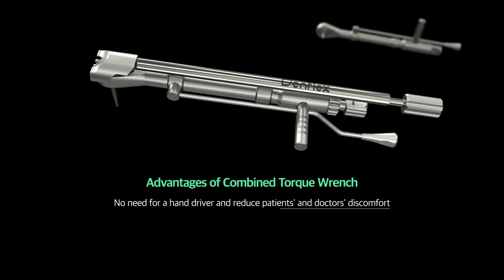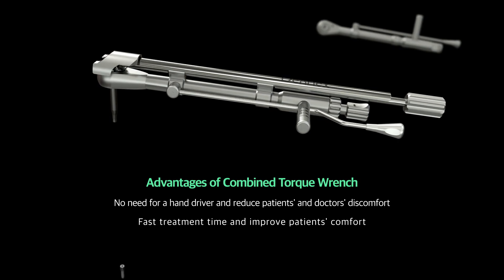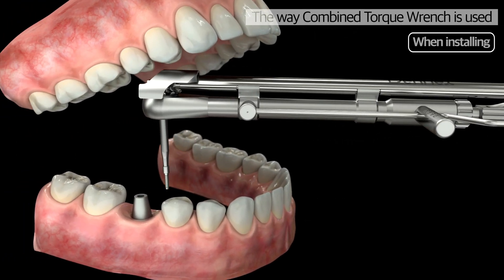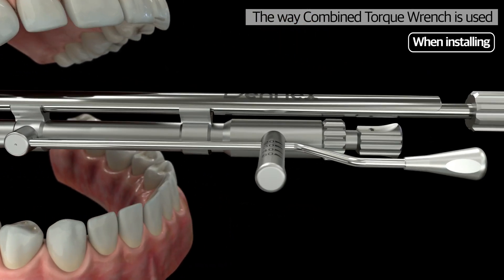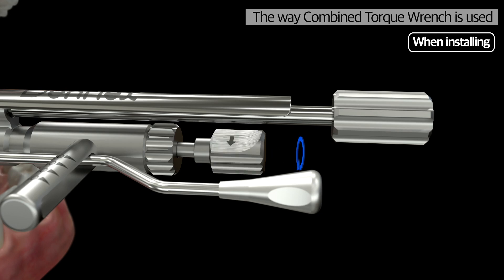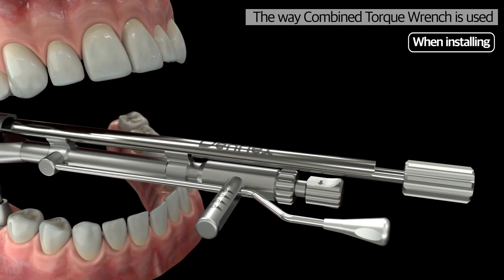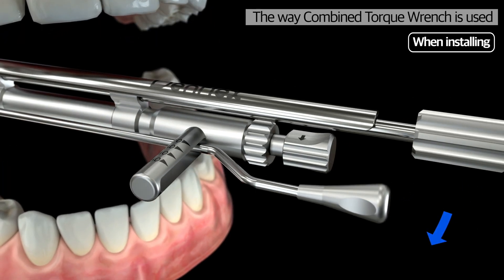DenFlex's Combined Torque Wrench reduces these problems with an innovative solution. Primary installation of the screw and binding can be done with one equipment, which eliminates the need of putting a hand in the mouth of a patient. The process of binding the screw with the handle and finishing the job with the torque bar can be done with one equipment.